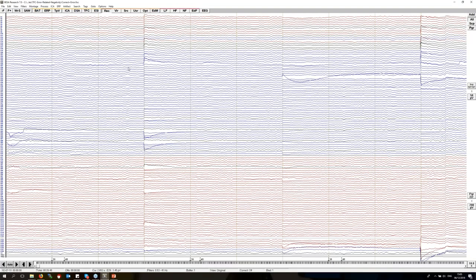So I have a data set that I always wanted to analyze in more detail. This is an error-related negativity data file, which was recorded in a 128-channel recording. We had a visual stimulus and a task. The task was either pressing the left or the right mouse button, depending on what was displayed, and that needed to be happening fast. This data here is already epoched and sorted according to correct and error trials. This is why you have these jumps, since these are different epochs.